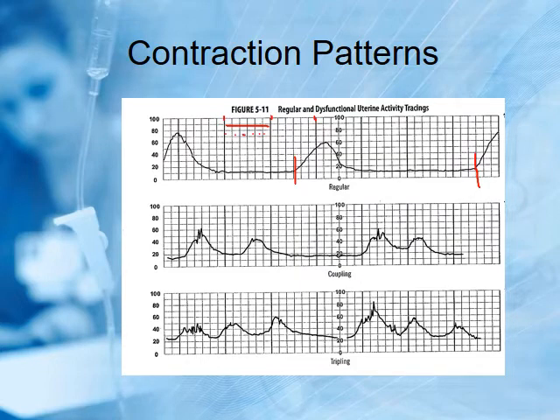60 seconds. So these heavier lines are a minute apart. The way that you would count these, if you see this is the third line in from the heavy line. See that? There's a heavy line. It's a third line in. So the third line in here is 1. Third line in 2. Third line in 3, third line in 4. These are every 4 minutes.